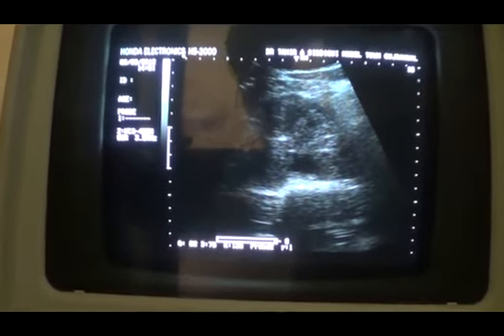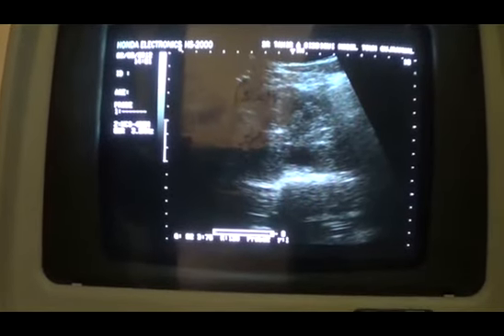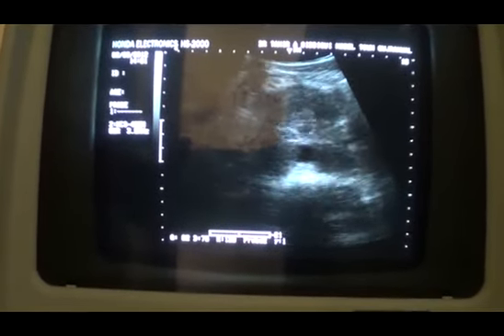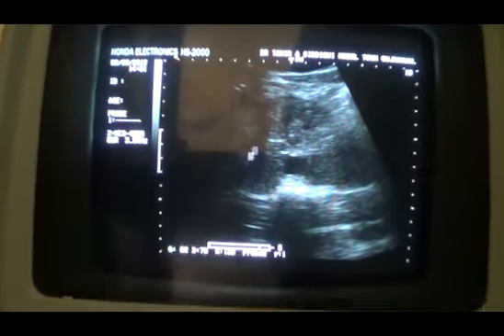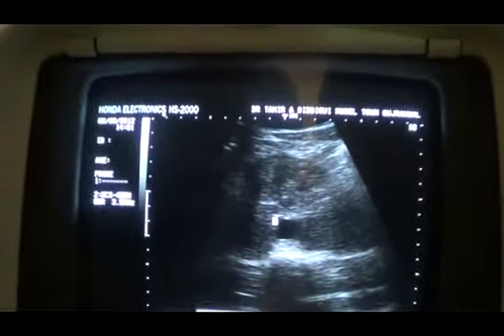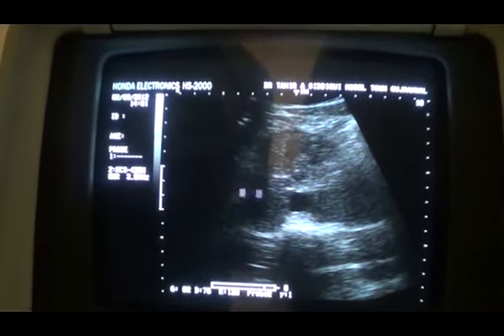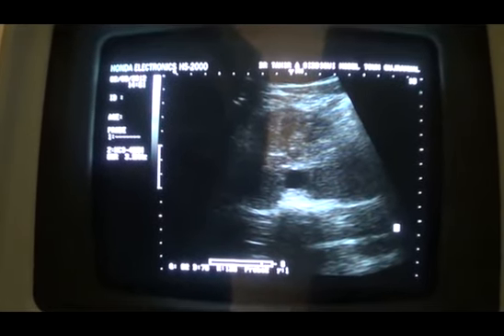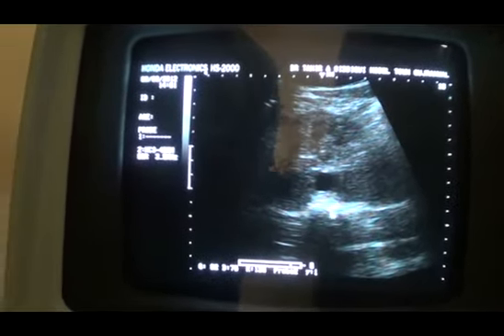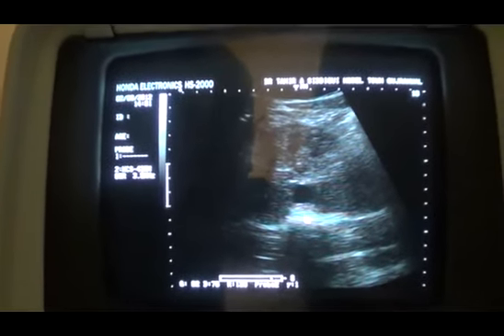Now, I am just going to give the findings, what I have seen, as this is the aorta. Now these are solid, well demarcated hypoechoic areas surrounding the aorta on the medial side, anteriorly as well as on the lateral side. This is the area of the L4, L5 spine, aorta, the umbilical region.